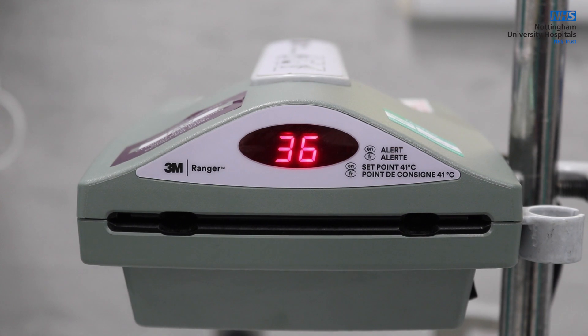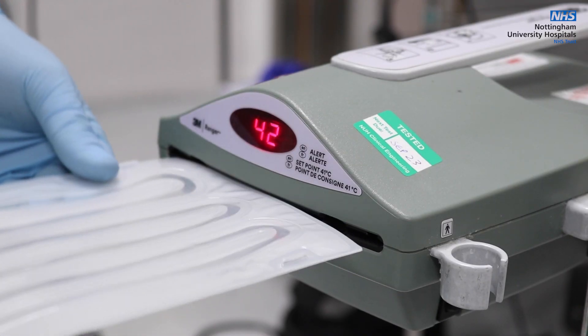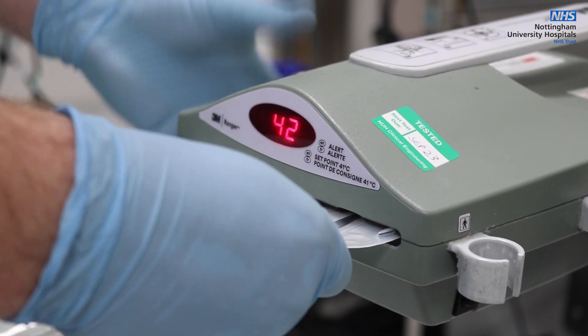The device is designed to heat IV fluids and blood to a fixed temperature. The set point for the device is not adjustable by the user. The appropriate set is inserted to the front of the device before fluid is primed through it.